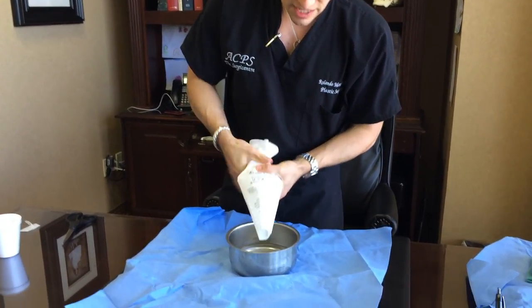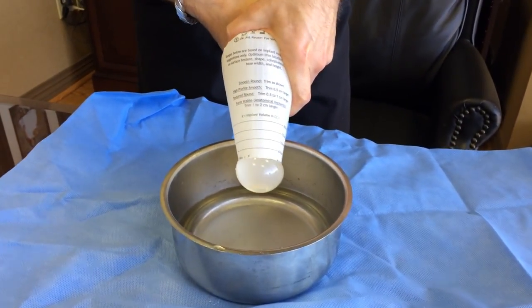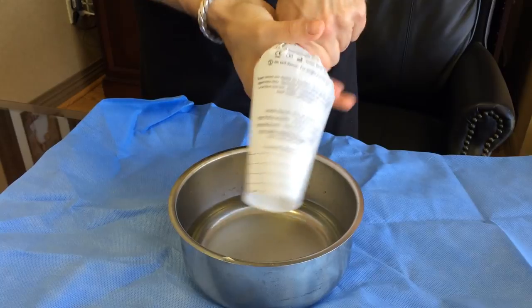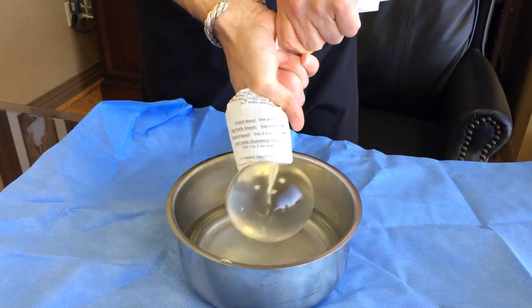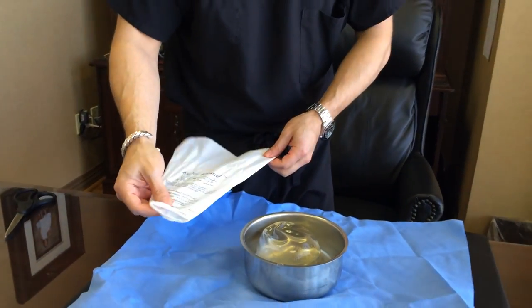Then I put it into the patient, and I squeeze, squeeze, squeeze. And then you can see the implant coming out. Squeeze, squeeze. And then there goes the implant, and it goes into the body. That's how the process works.